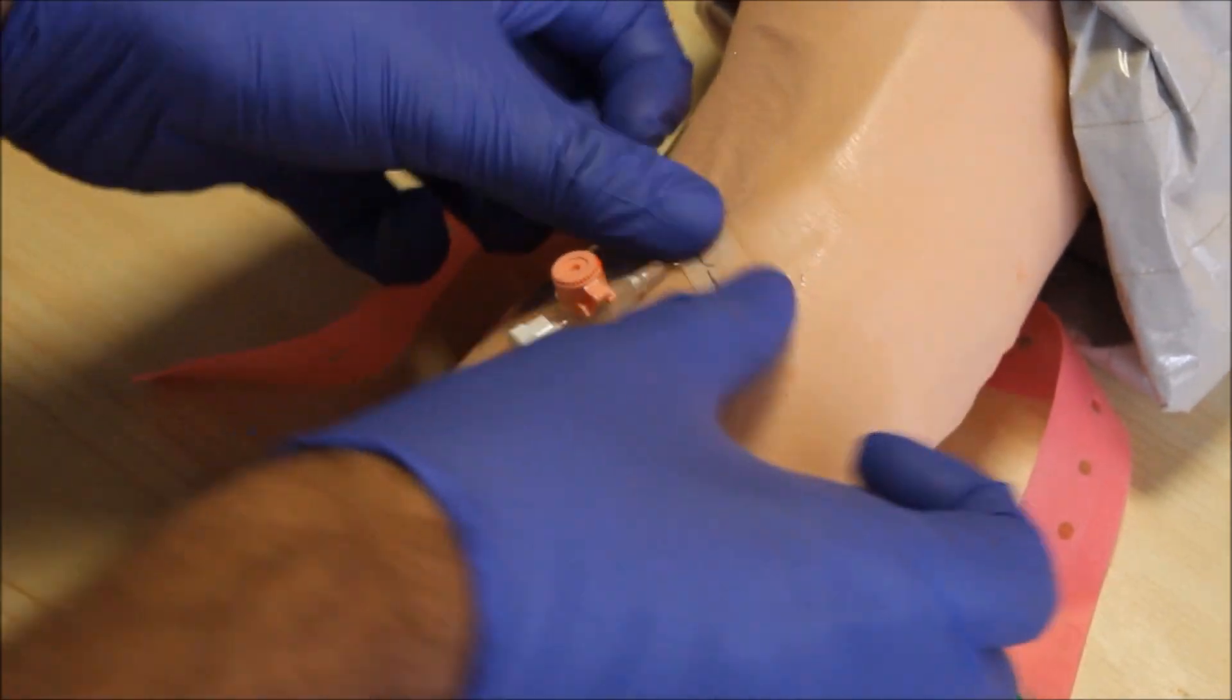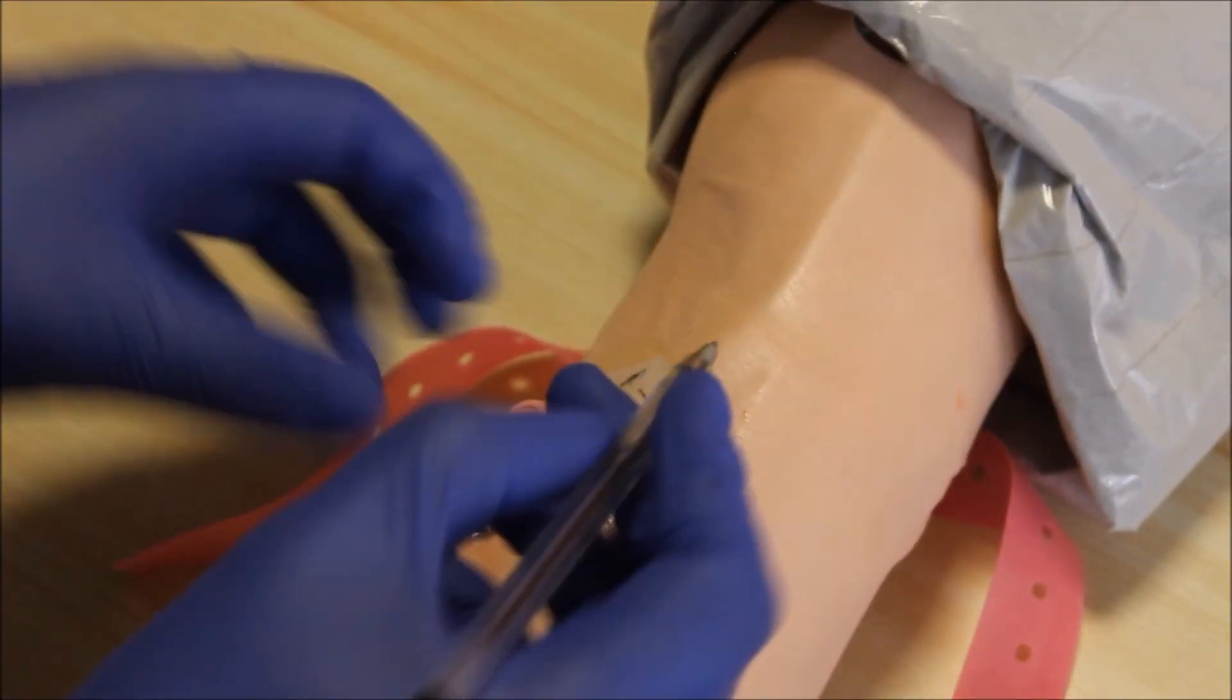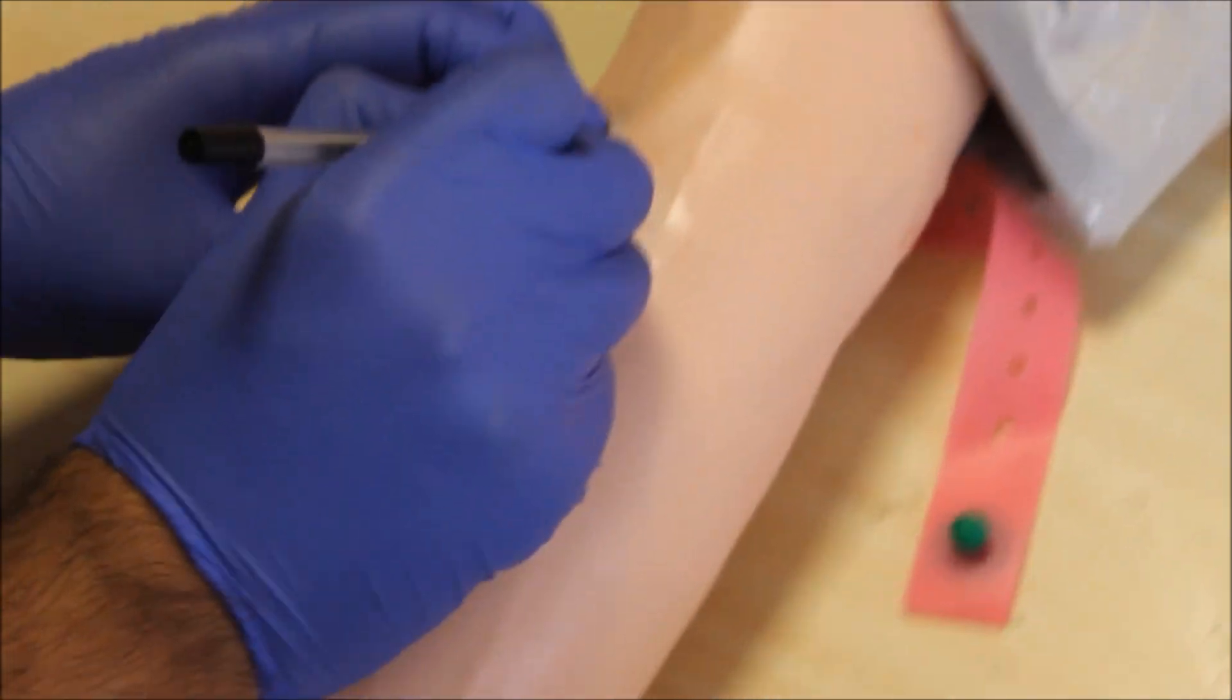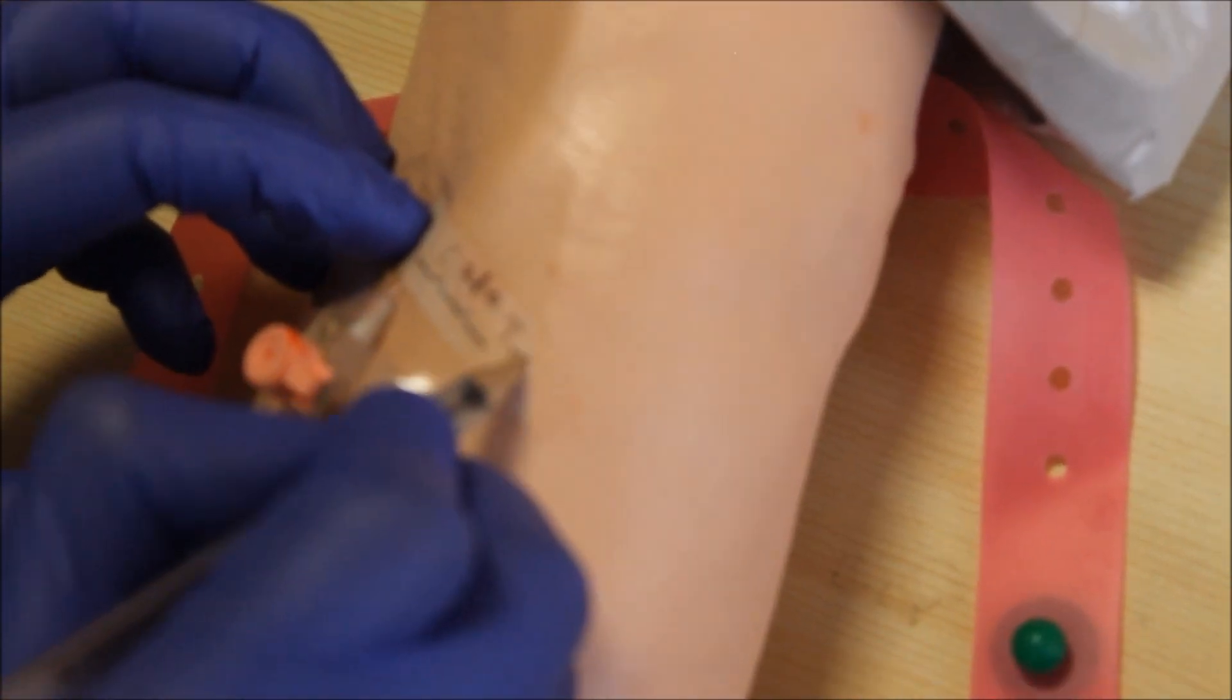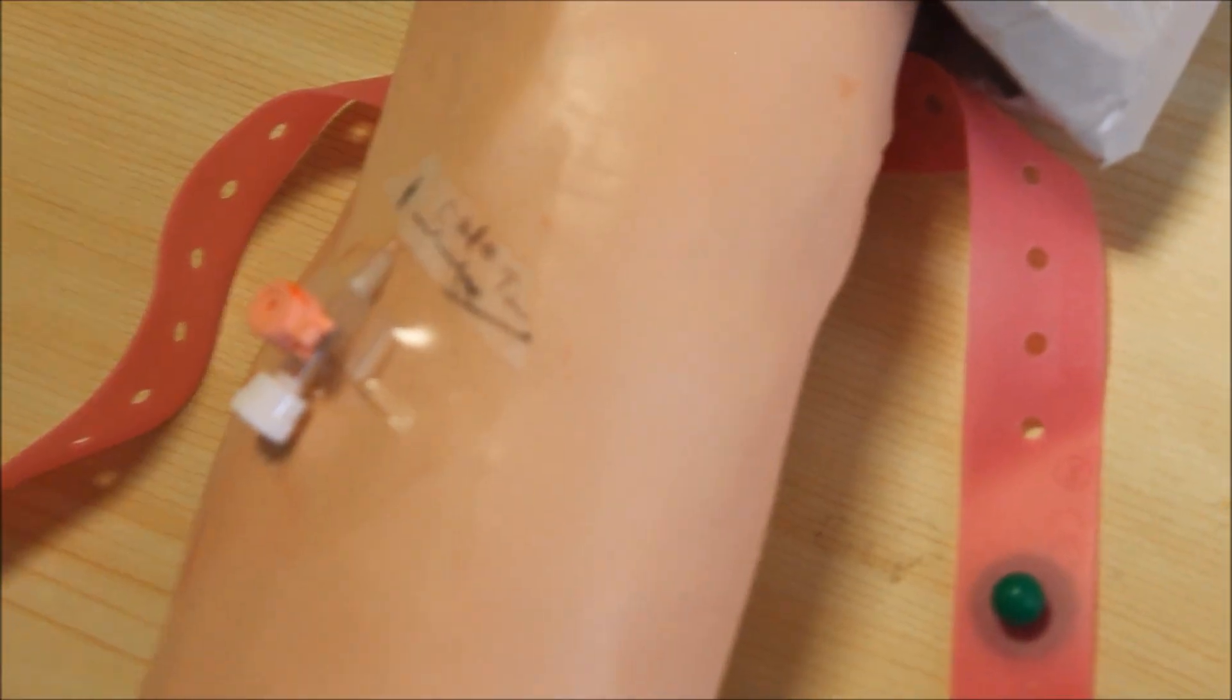Put the date, the time, and your signature on the cannula.